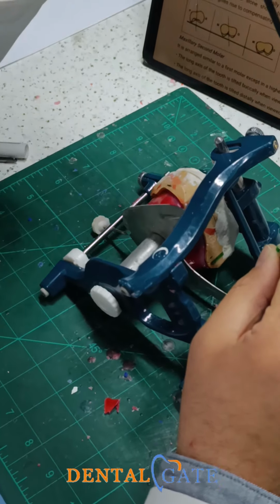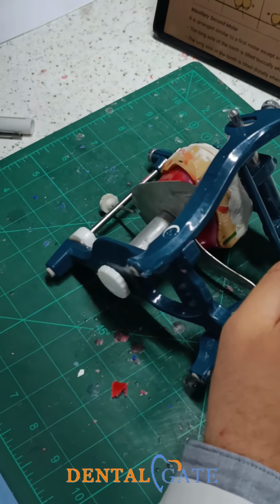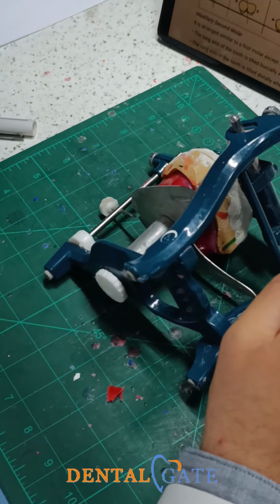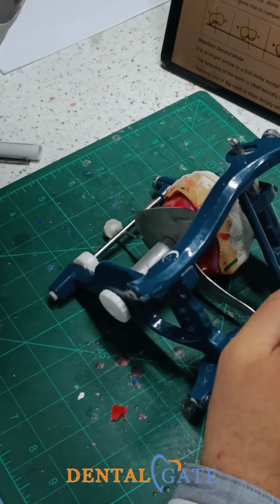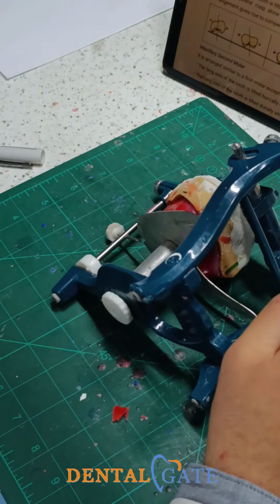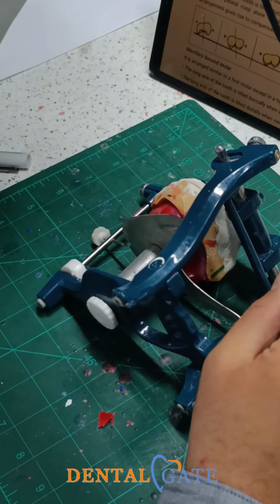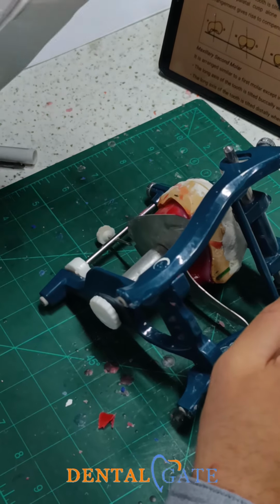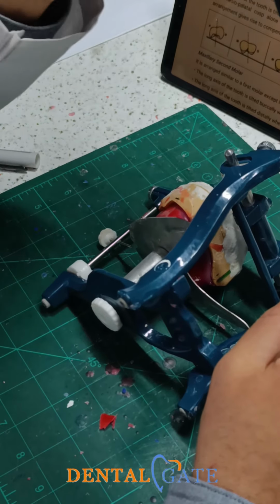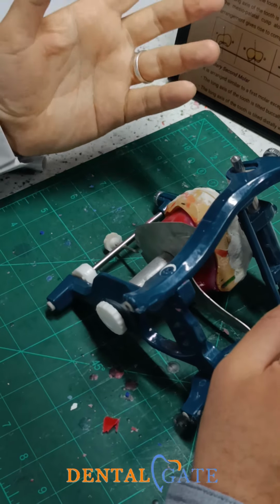If you want, don't follow this criteria. Make it with a tilting. Yes, when you make it with a tilting, the space will be performed with these gaps. The gaps within the cusps, okay, should not be equal. Because if the gaps within these 3 cusps are equal, there is no tilting. My objective is to make a tilting. Okay?